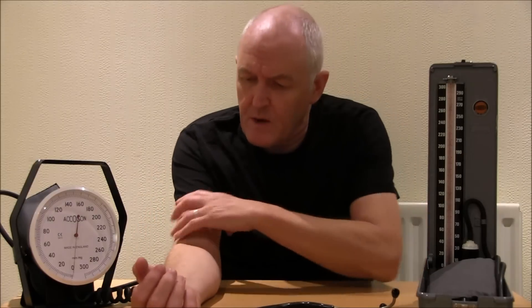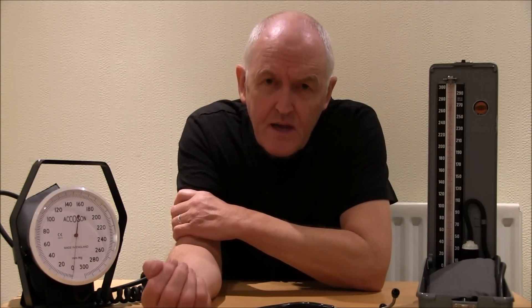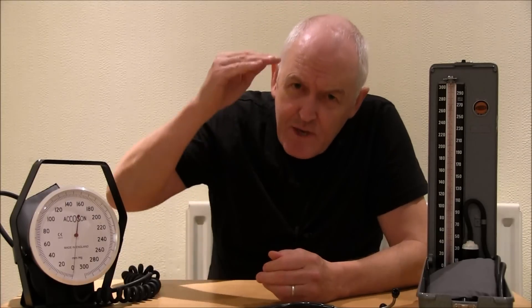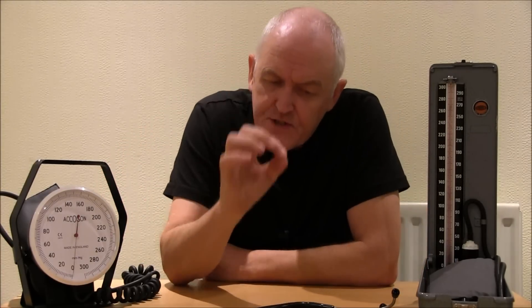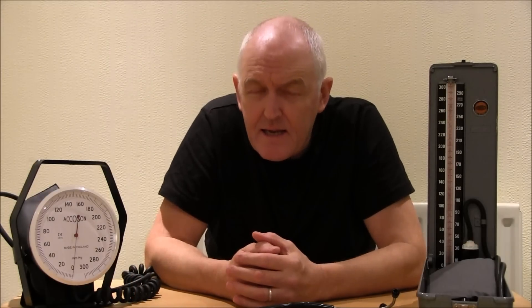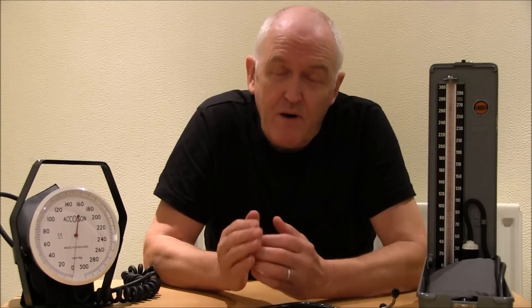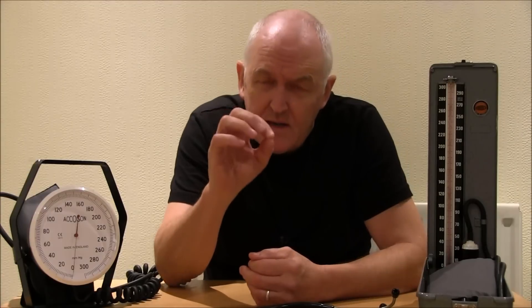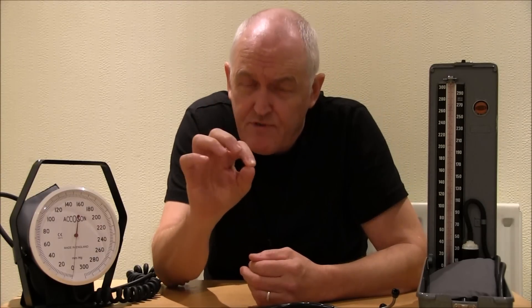We put the cuff on and pump it up above the systolic pressure — that is, above the pressure at which the heart is contracting during systole, when the left ventricle is contracting. As we let the pressure down, when there's just sufficient pressure for blood to get past the cuff on the top of the arm, we can hear that in the brachial artery. We used to think the sounds were caused by turbulence of the blood in the arterial vessel, but physicists have now told us that would generate lower frequency sounds. The sounds we're actually hearing are caused by resonances set up by the arterial wall itself — but in practical terms, the sounds represent the same pressures.